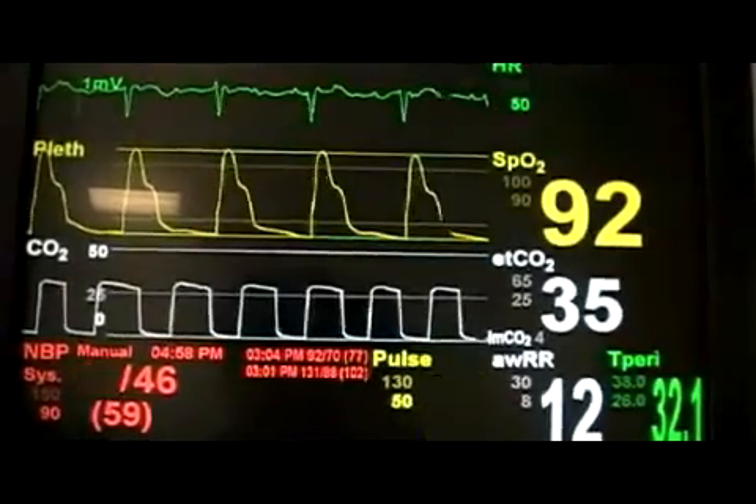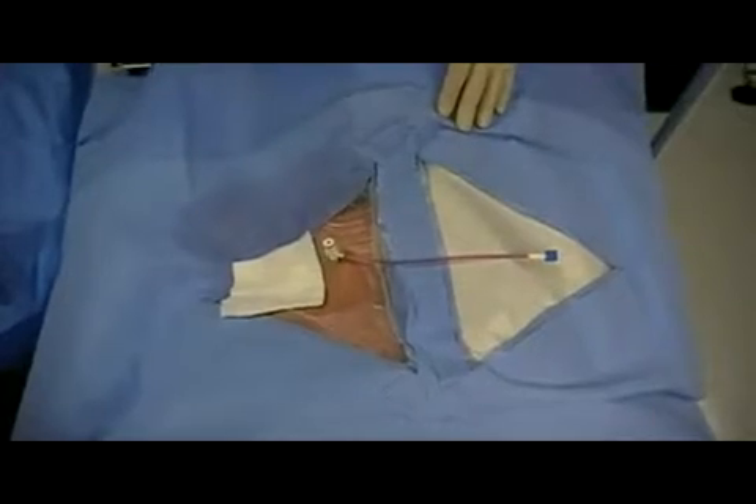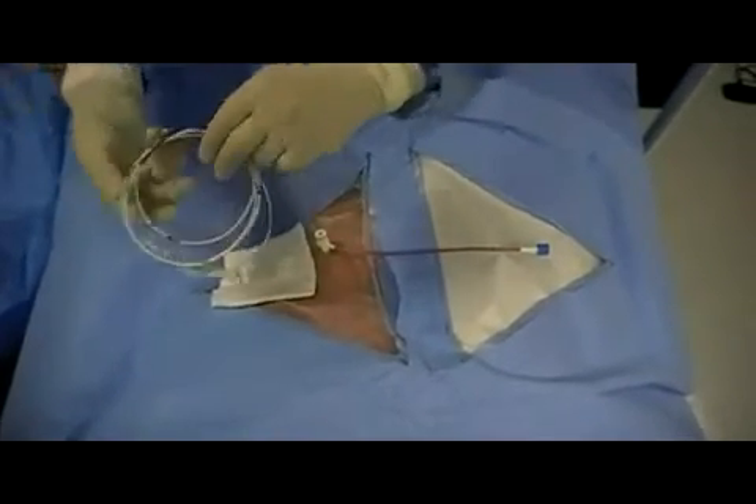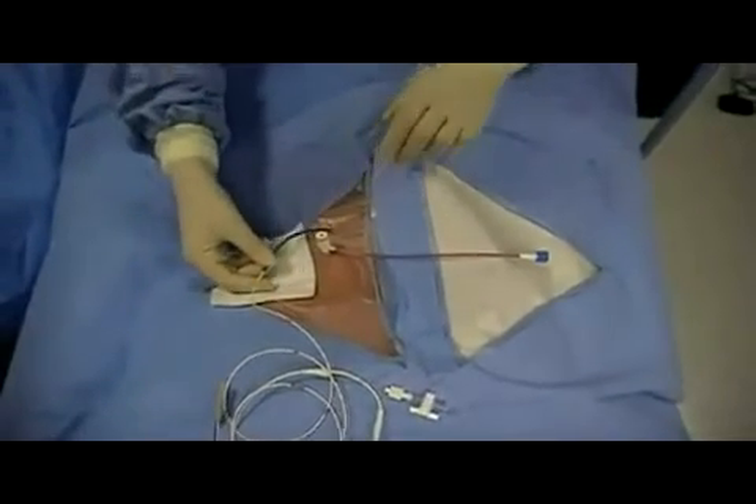This patient's pacer is being placed for third-degree AV block. The next step is to prepare the pacing wire, which should be uncoiled onto the patient.